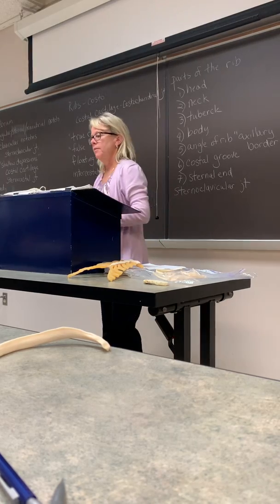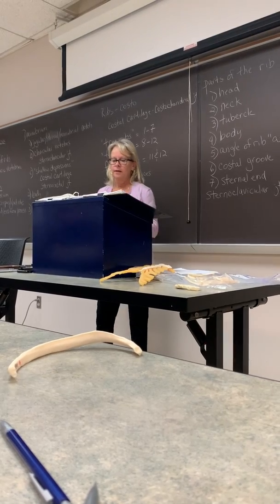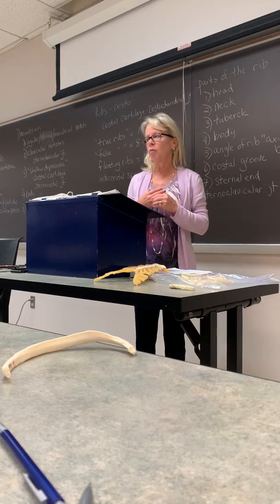Okay, imaging. Imaging of the sternum and ribs. A couple of things that you need to know. First of all, they recommend 30 inches SID for oblique sternums.